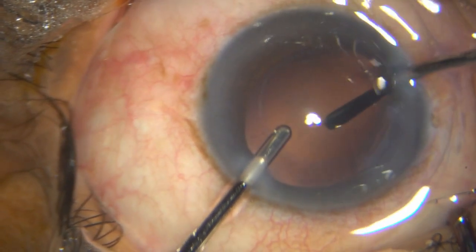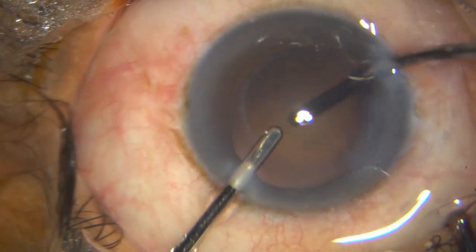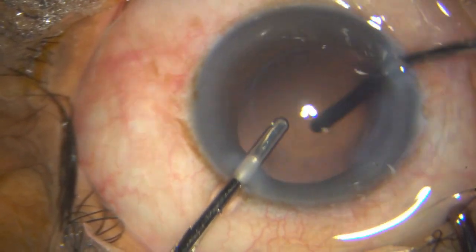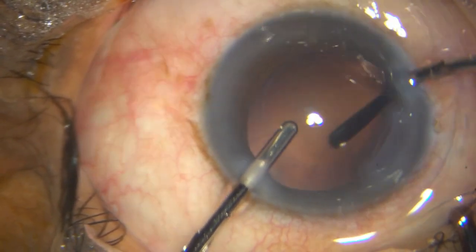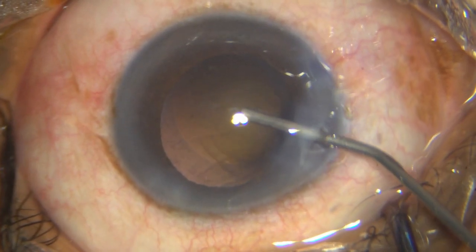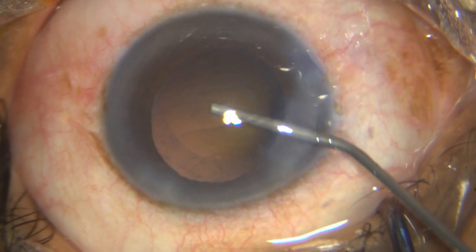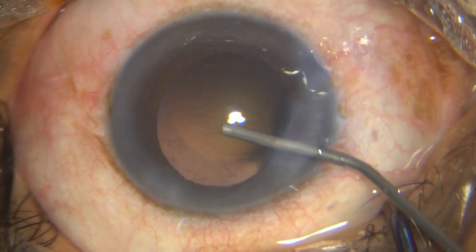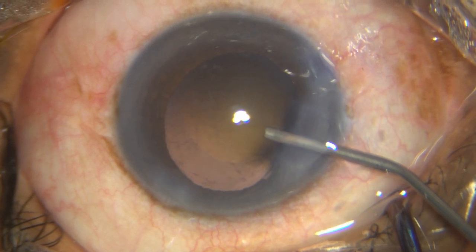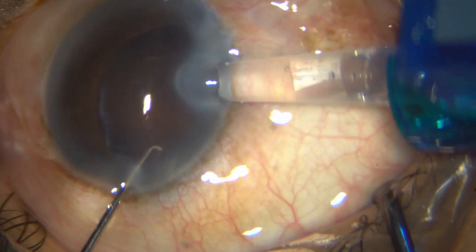So I go with my vacuum mode. You have to be very careful with this step. I take out as much as is safely possible to remove, and then I sort of almost polish off the rest with my visco cannula. This is a very effective technique. Just scrape it off the posterior capsule. Most of it comes off very easily, and it's a very safe technique. That's the main thing.